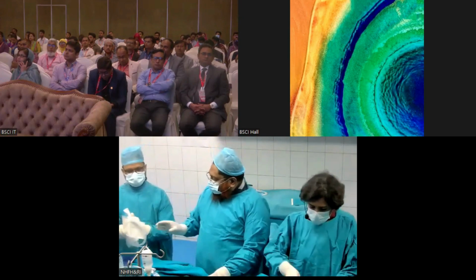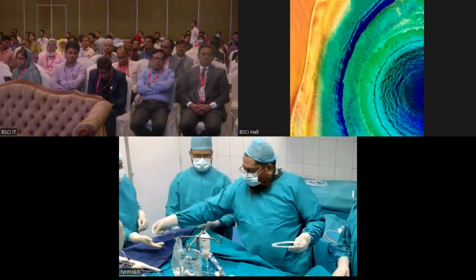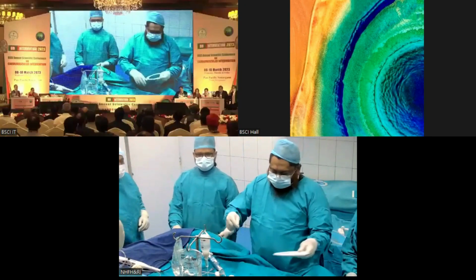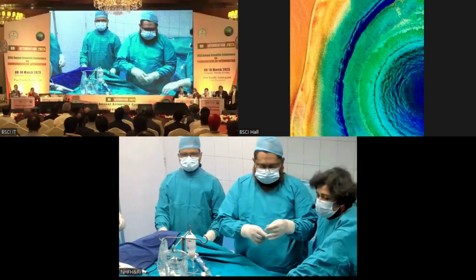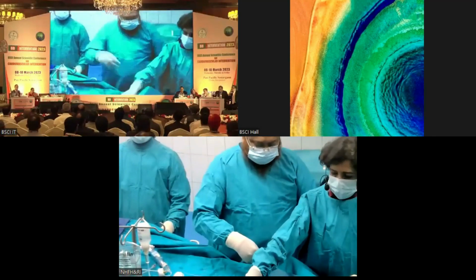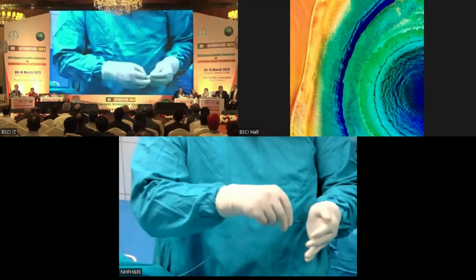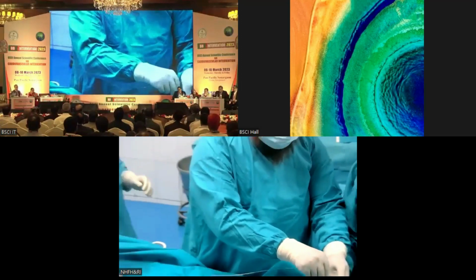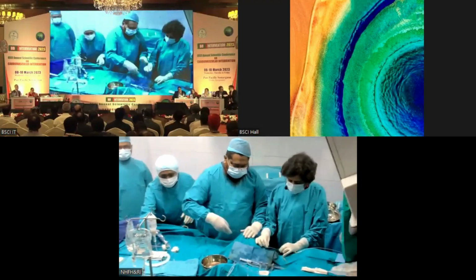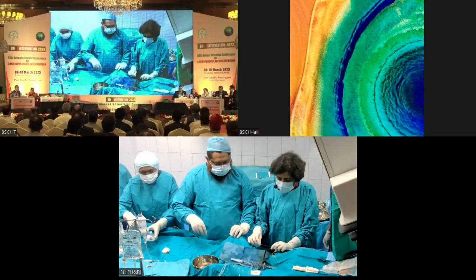What is the guide catheter you have used? Is it an XB? Yes, it's an XB. For us, it is customary to use an XB for all types of lesion. That is our workhorse catheter, you could say. We always use XB for the left side. So now we are taking a 3.5 by 48 Synergy from left main.